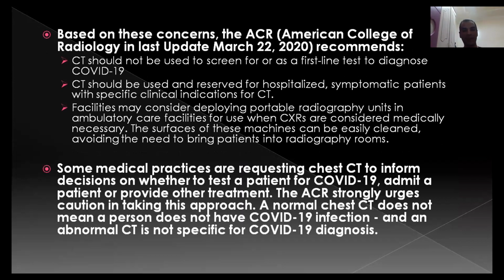Some medical practices are requesting chest CT to inform decisions on whether to test a patient for COVID-19, admit a patient, or provide other treatments. The ACR strongly urges caution in taking this approach. A normal CT doesn't mean a person doesn't have COVID-19 infection, and an abnormal CT is not specific for COVID-19 diagnosis.